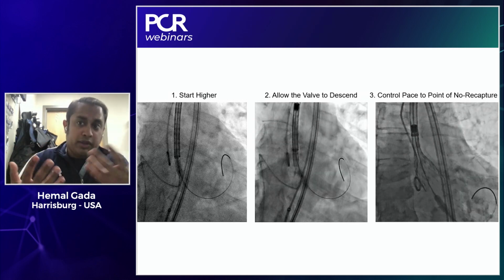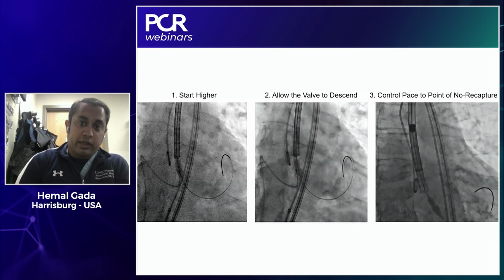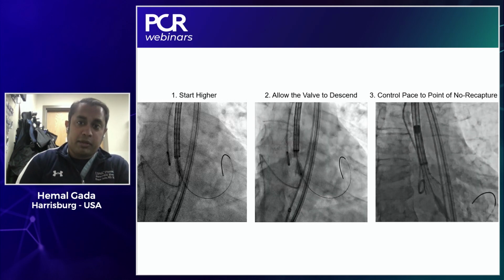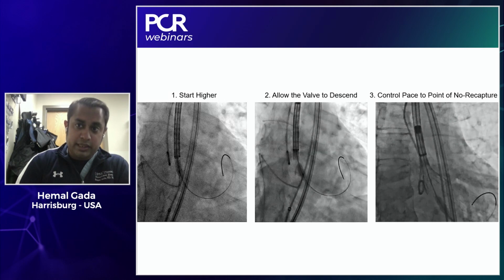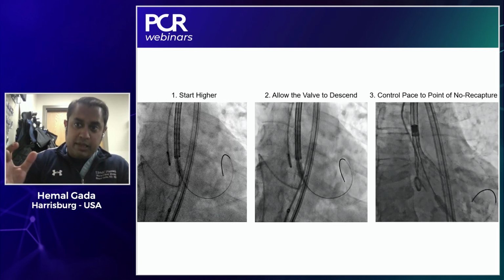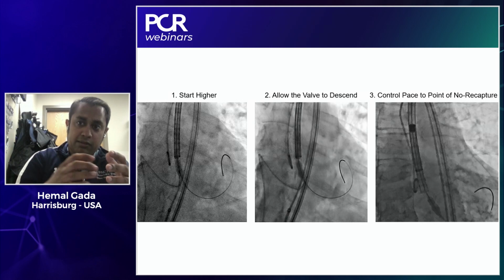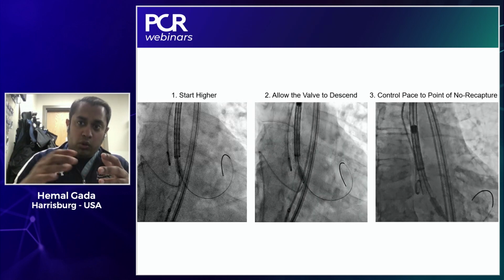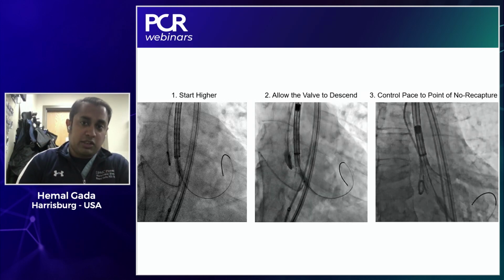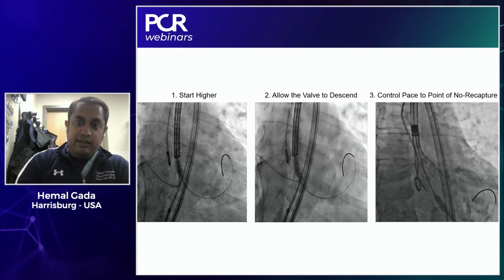I would argue that we usually pace at a higher rate than what Mohammed showed in this particular case. We typically pace at a rate of 180 beats per minute if the patient can tolerate it hemodynamically. Clearly, that's idiosyncratic. If the patient has a poor ejection fraction, bad coronary artery disease, they're hypotensive. We just want to get the pulse pressure down so the valve stays stable around that third or fourth node. Once it touches or abuts that non-coronary cusp insertion, flaring out to the left and right is much more controlled and horizontal flare versus having any kind of translational movement to it.